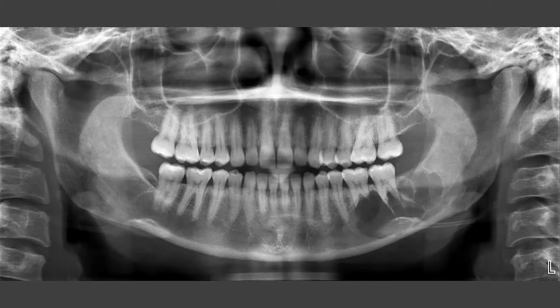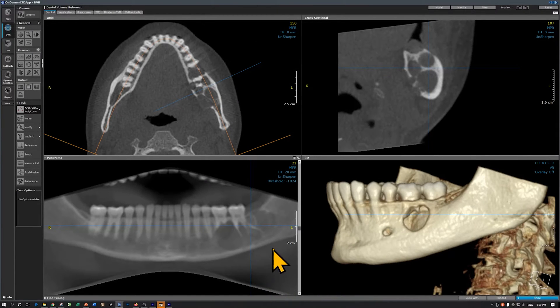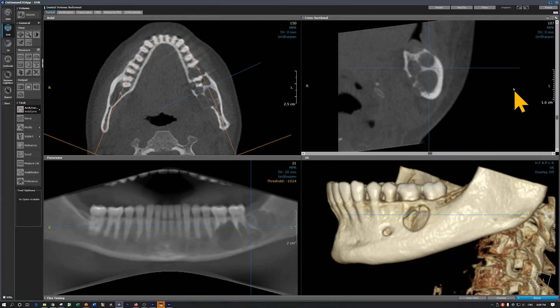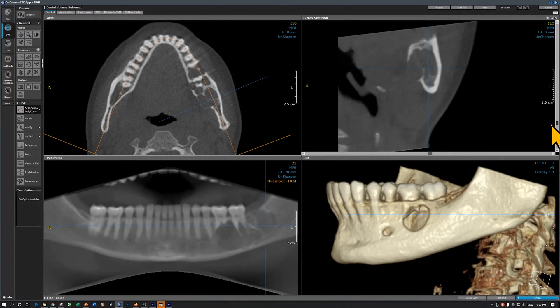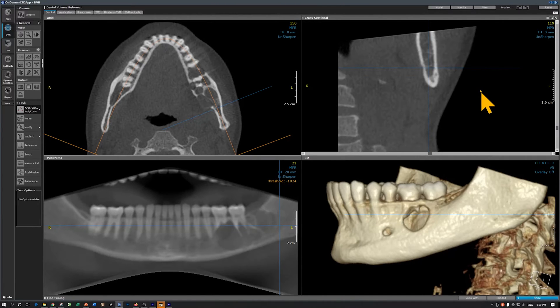I have a CBCT scan of the same patient. Let's review that. This is the mandibular CBCT scan of the same patient, and here is the lesion of our interest. This blue vertical line represents the image on this window. Let's look at this window coming from posterior. This is the buccal cortical plate and that's the lingual cortical plate, and I'm going to scroll through the images.